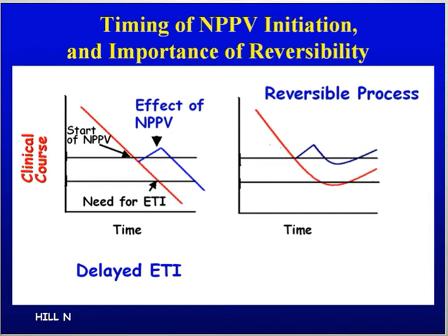Please. You told us that more than 50% of your patients admitted to the ICU have been under non-invasive ventilation before admission. That means that they have been started with non-invasive ventilation in the bedroom of the patient, say with a pulmonary edema or something like that.